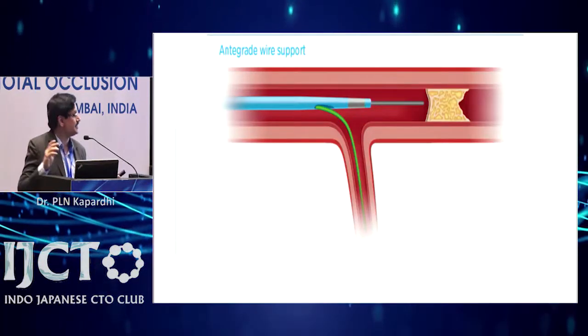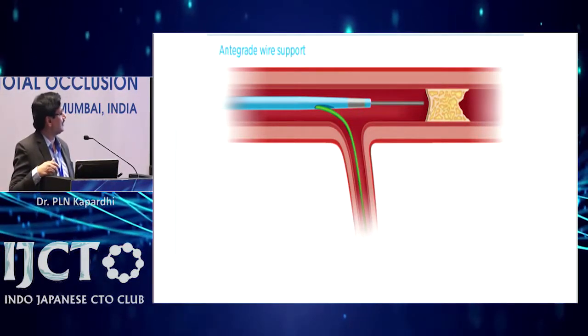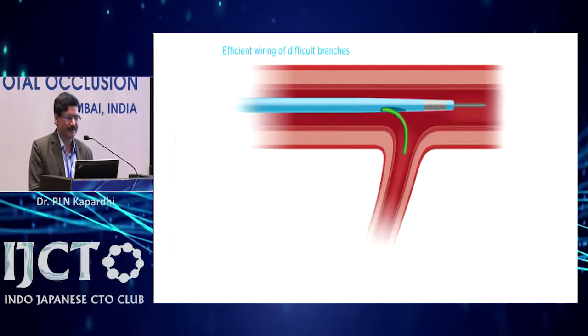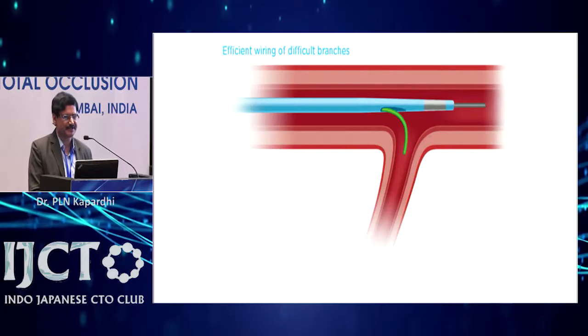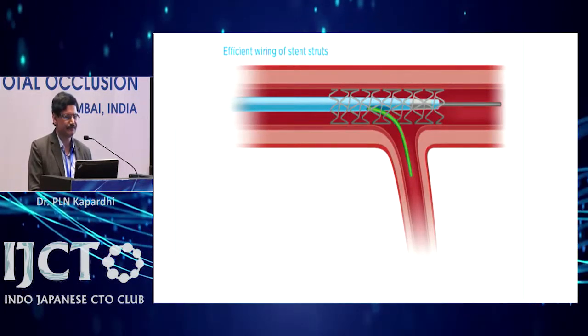And of course, this is mistakenly this one. Actually, this should be here, and the side port we can use to penetrate the proximal cap. Of course, other uses are for side branch tracking, as well as crossing distances it can be useful.